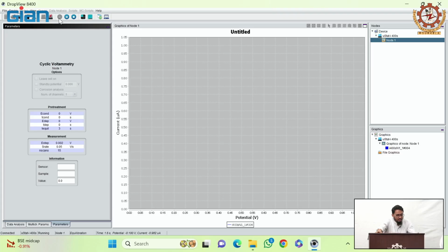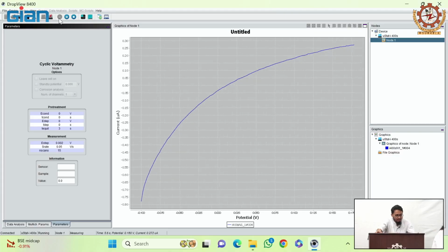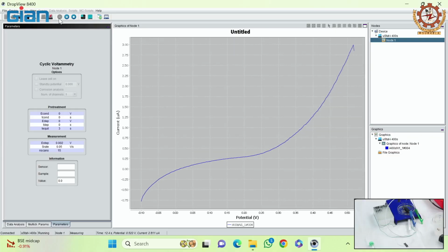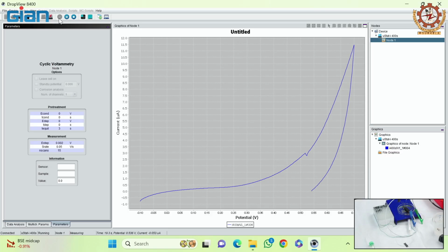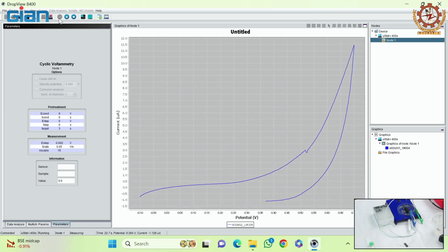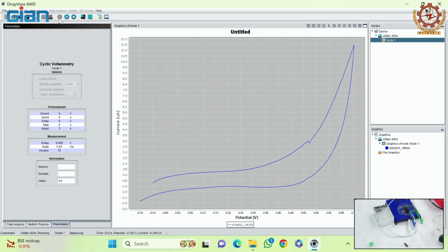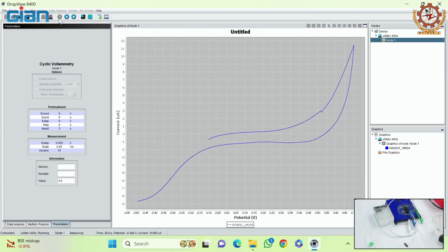This step is going to take some time because there are 15 scans. So we'll have to wait patiently and we'll monitor the CV curve. If we observe that there is some noise or instability on the CV curve, we'll have to stop and fix it. The CV curve for electropolymerization will look slightly different from the CV curve that you have observed during the working electrode checking process.